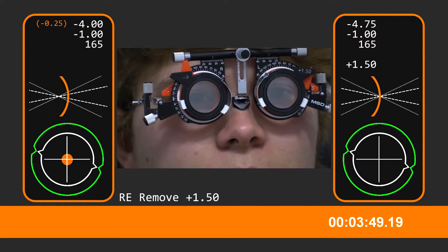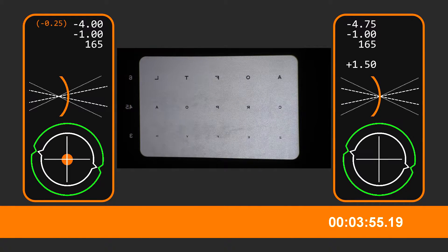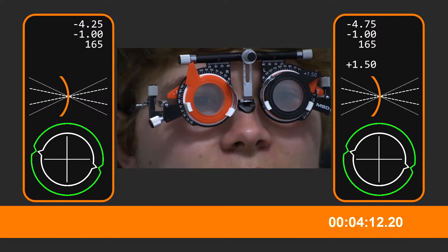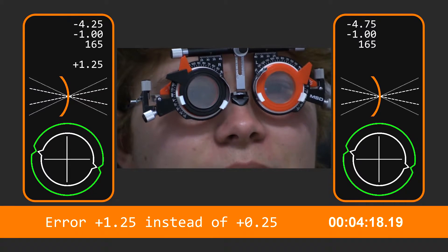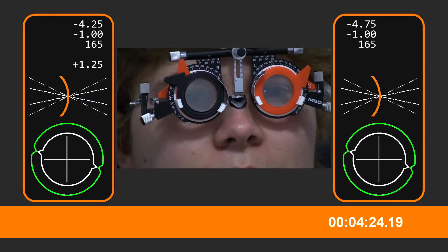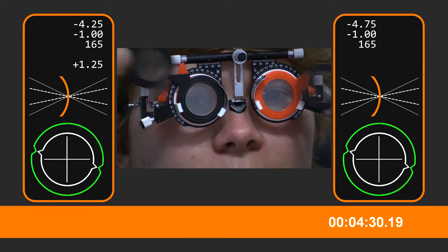And then we're on the right eye now. Where can you get to? Going for that middle line — C, R, F, G, L. Better with this one or better without? Without. Let's have a look — keep looking at those letters. What happens if I put this one in? Better with that.